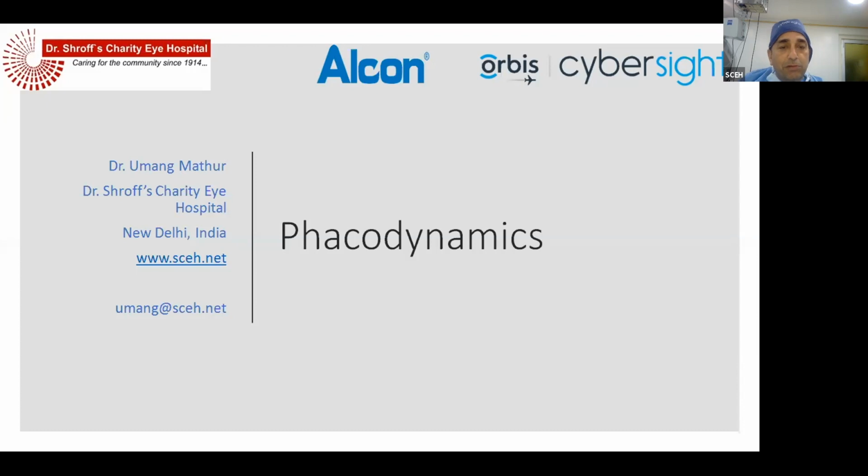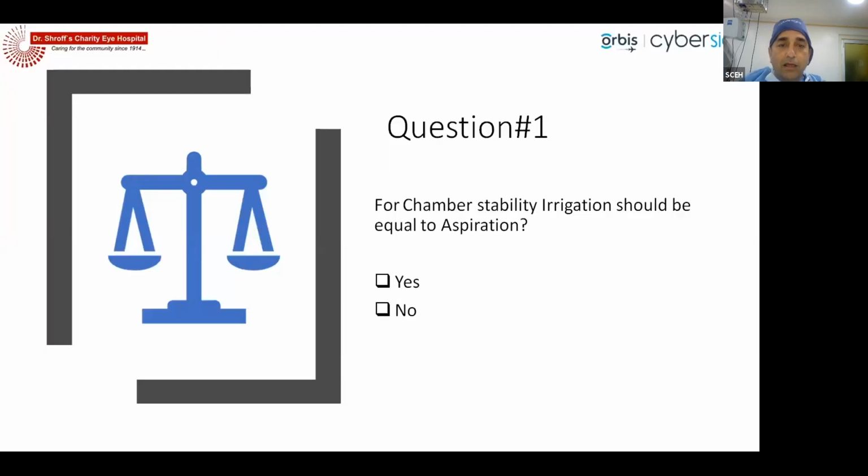So I thought before we start the surgery, we'll just discuss a few terminologies that we use in Phaco. And before we start, here are a few questions for you, and you have a polling system available for you. The first question is, for chamber stability, irrigation should be equal to aspiration. Is that a yes or a no?